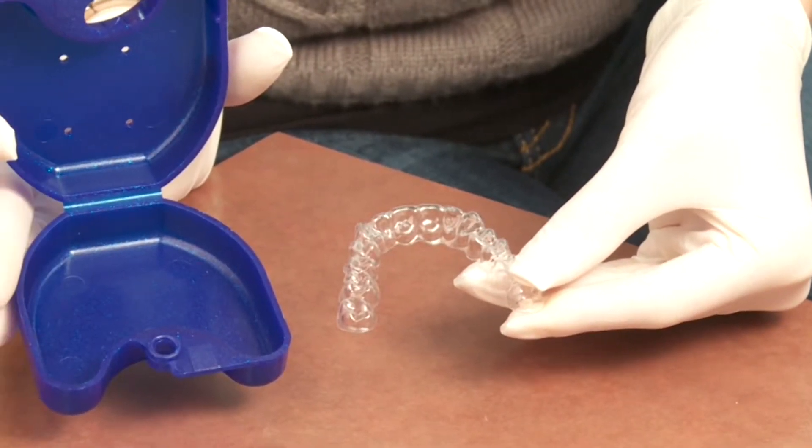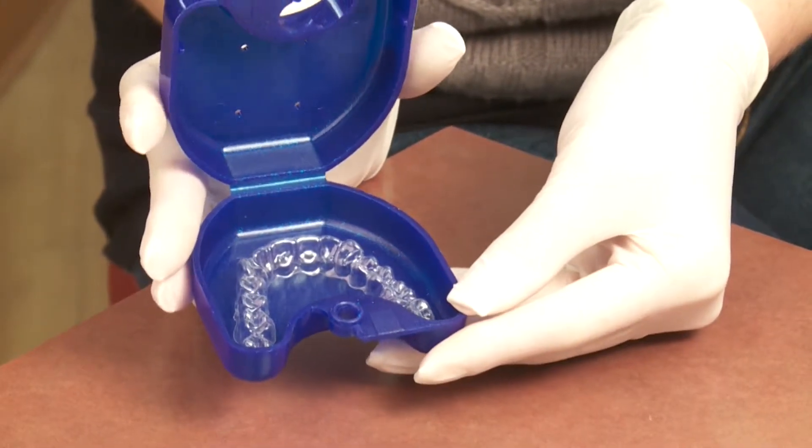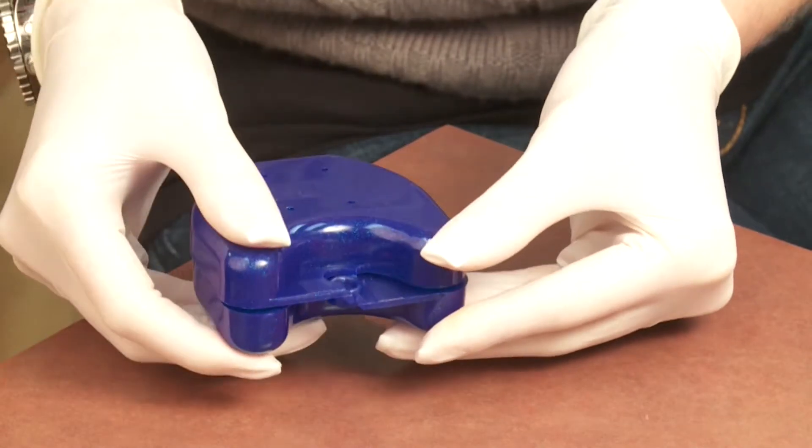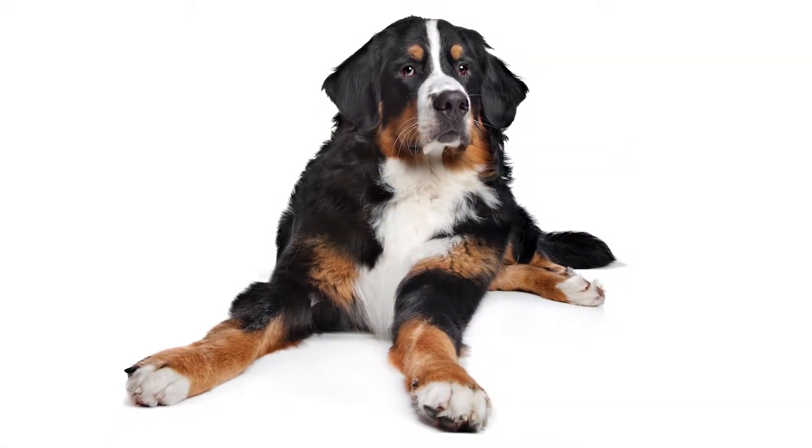When you do take them out, say to eat, remember to keep them in the case you've been provided. Don't just put them in a napkin — that's an easy way to lose them. And be sure to keep them away from family pets too, as they love to use them as chew toys.